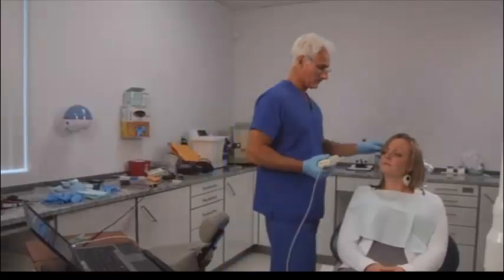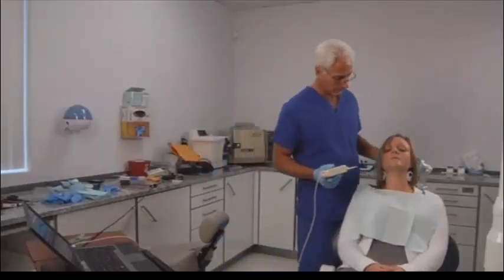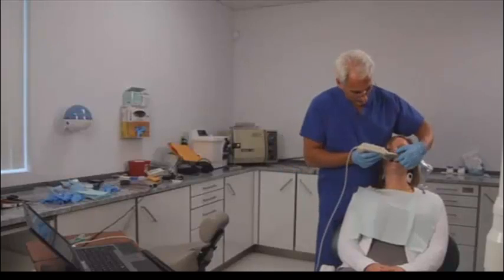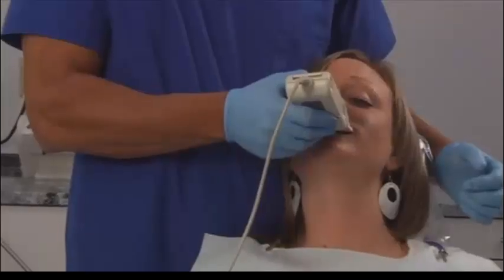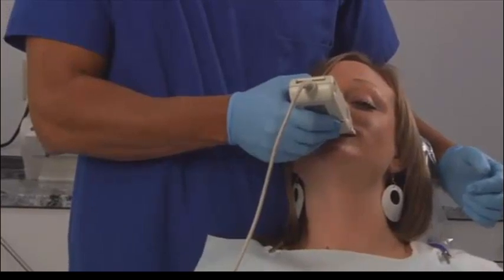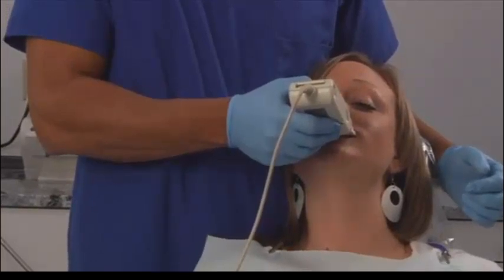Okay, Caroline, so now we're going to do sliding straight forward. Head back again. Going to rest this on your teeth again. I'll have you close once firmly. Bite down firmly. Stay there. Now go forward. Good. Very good.